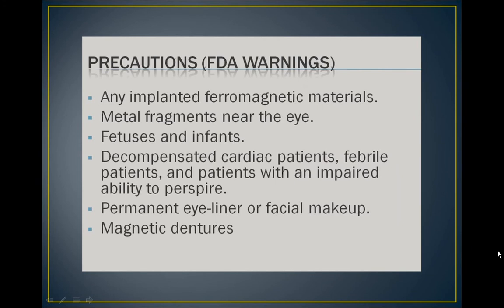Patients do not know how powerful the MRI magnet is, and we constantly need to remind ourselves how dangerous the MRI machine can be so we can screen patients properly and keep a safe MRI environment. Remember that the magnetic field is always on.